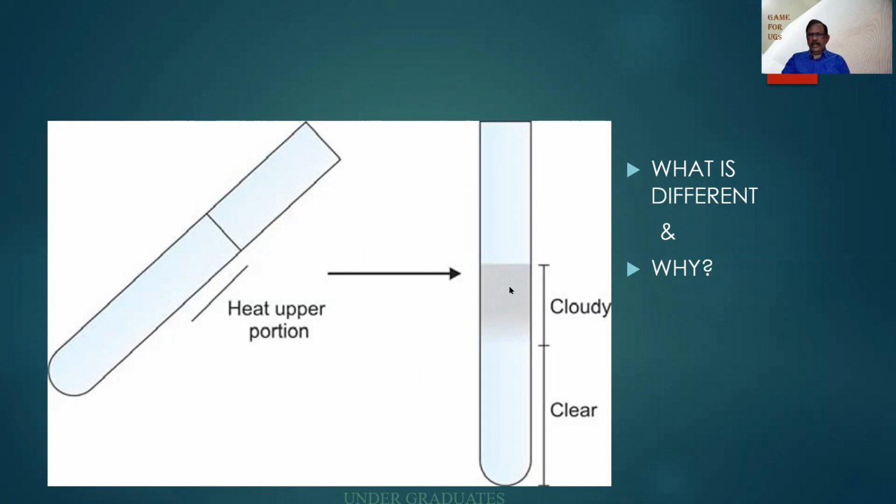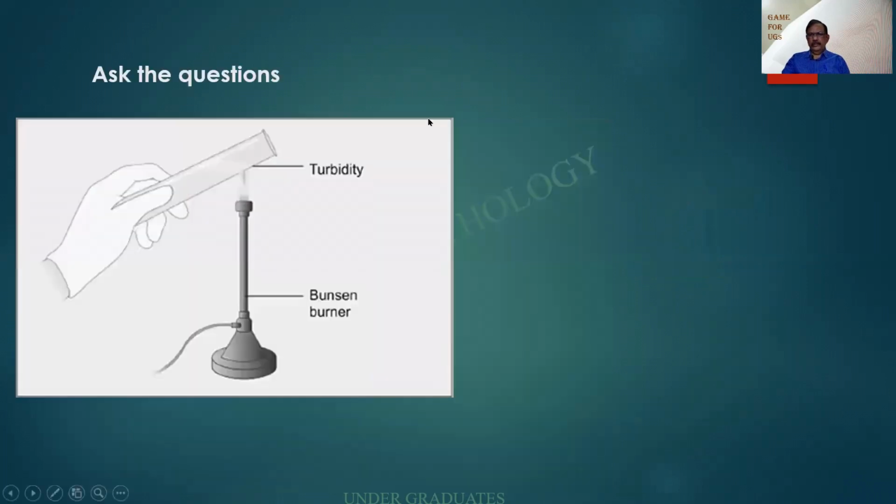Why is the test being done like this? I would like you people to answer. In fact, this will be asked. And second one is, how do you do this test? Most students say that it is by using a test tube holder.